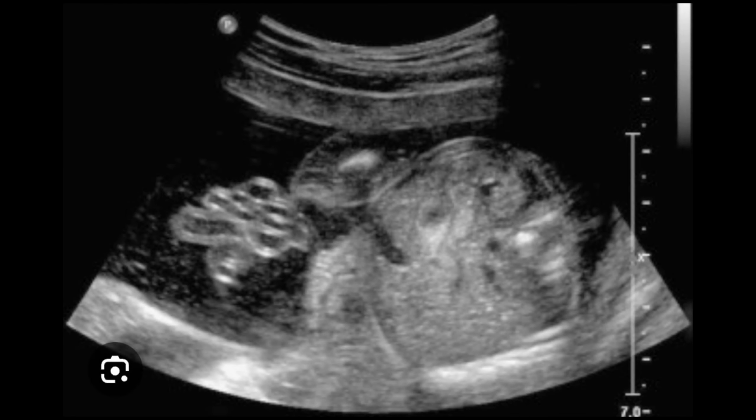This is a gastroschisis ultrasound image. You can appreciate that the free bowel loops can be seen within the amniotic fluid. The one thing you have to take into account is whether this is umbilical cord or true intestinal loops. For that you need to have Doppler signals on it. After the Doppler signal, you can confirm whether these are umbilical cord vessels or truly intestinal loops.